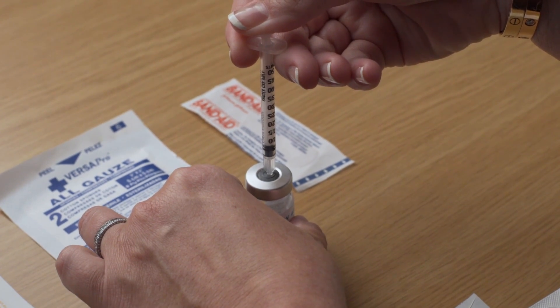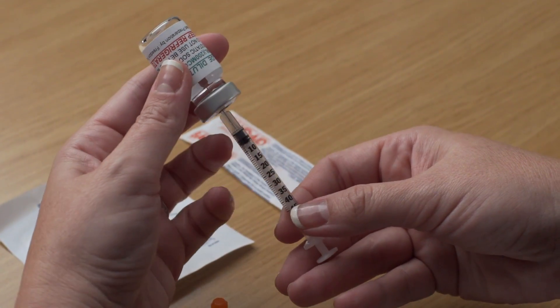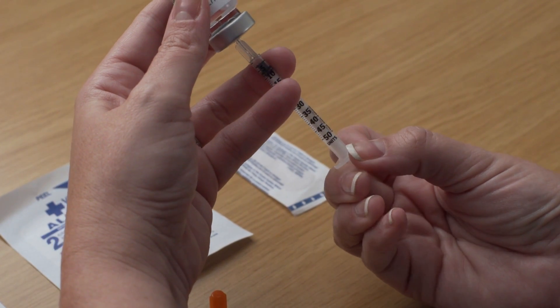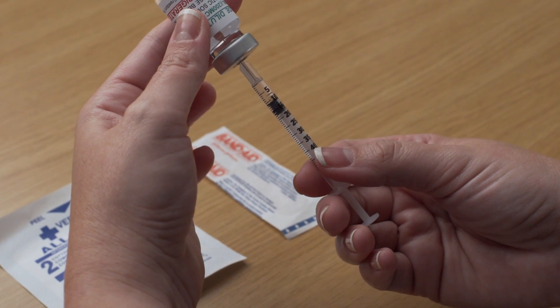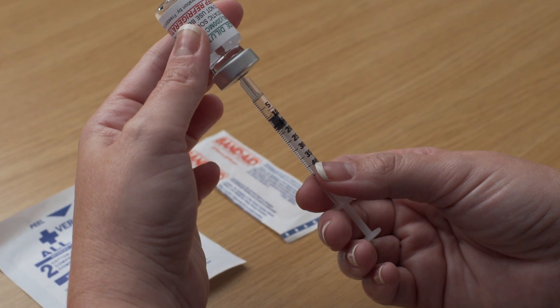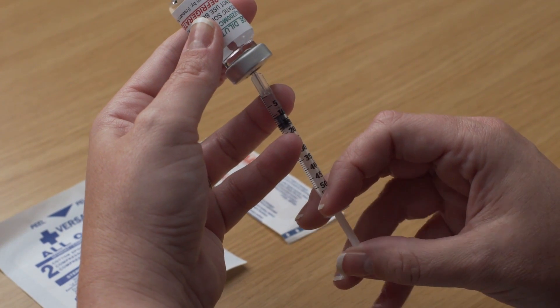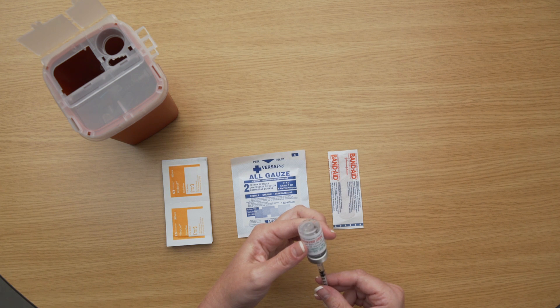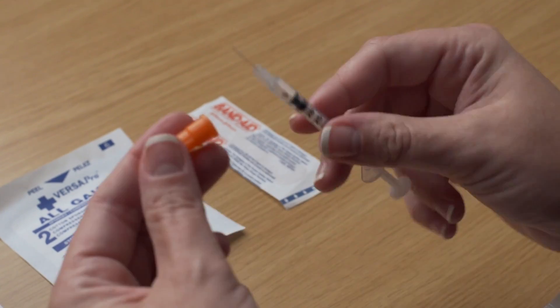While keeping the needle in the vial, lift the vial and turn it upside down so that the needle points toward the ceiling. With the needle tip in the liquid, slowly pull back the plunger until the syringe fills to slightly more than the mark for your prescribed dose. Next, keeping the needle in the vial, slowly push the plunger to your prescribed dose to clear away any air bubbles. Remove the syringe needle from the vial and recap the needle. The syringe is now ready for administration.